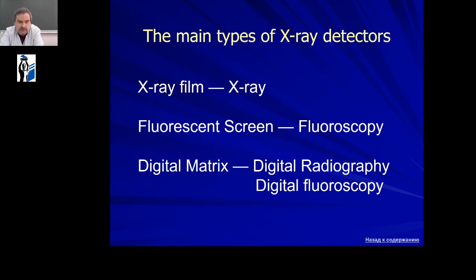The second is the fluorescent screen, used in fluoroscopy. And the third is the digital matrix, used in digital radiography and digital fluoroscopy.